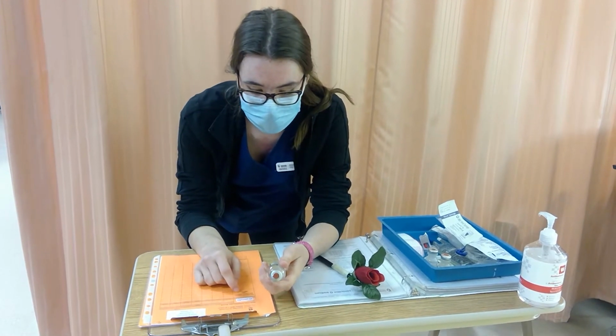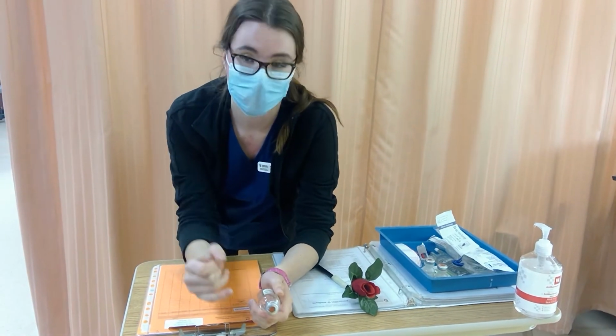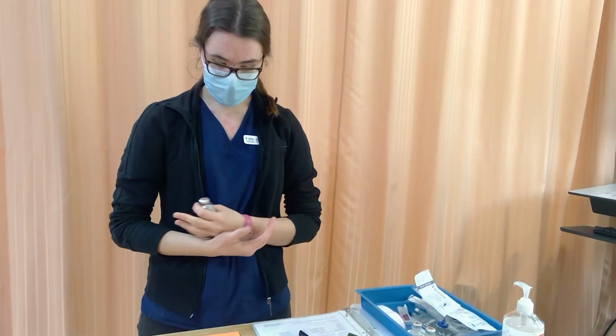We're going to be giving it in a mini bag, and it says we can give it IV here, every 6 hours. It's 12 o'clock, so it's due to be given now. Originally it said SIVP on the MAR, but we ran it past the pharmacy, we checked the PDM, and I suggested to give it by mini bag so that it'll be more diluted and we'll have more time to intervene if he does have a reaction. So we cleared all of that.